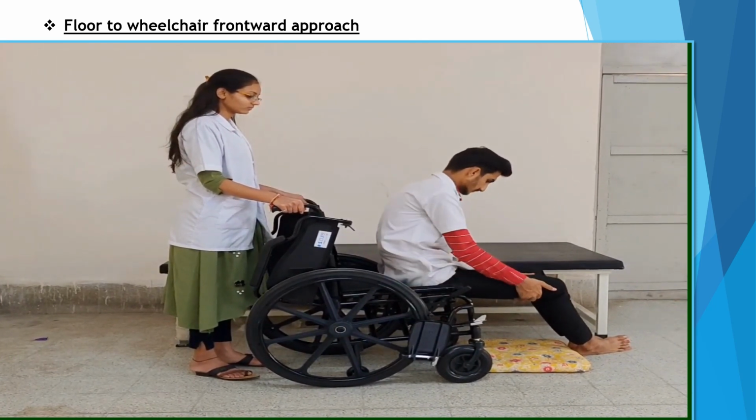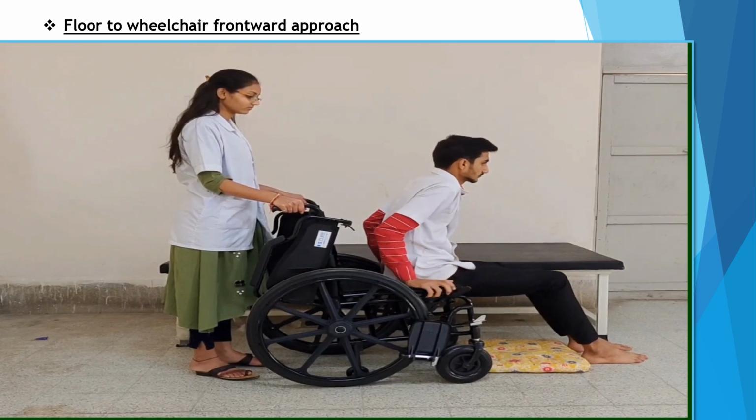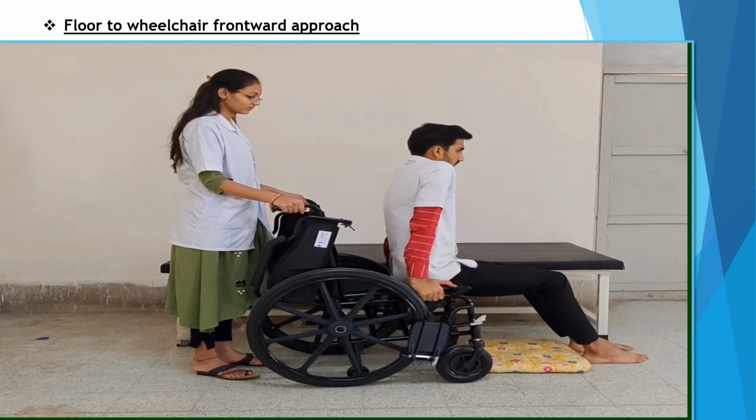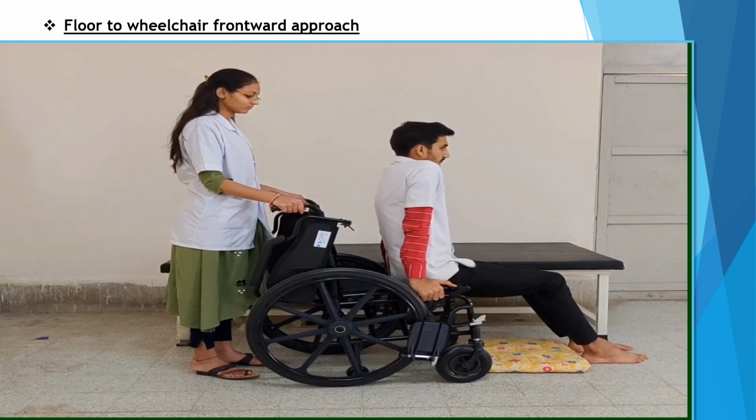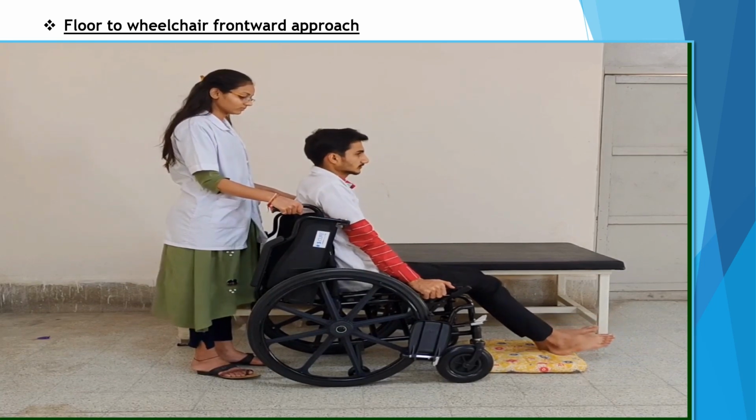Step 4. Shifting and positioning into an upright position. The elbows are extended and shoulders are adducted and depressed to vertically shift the body into an upright, comfortable position.